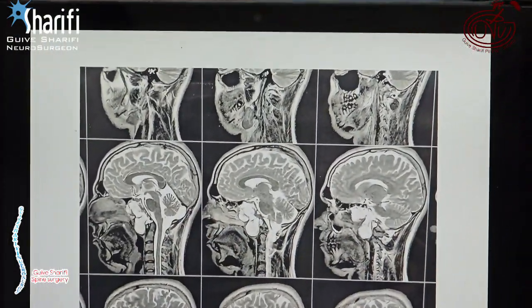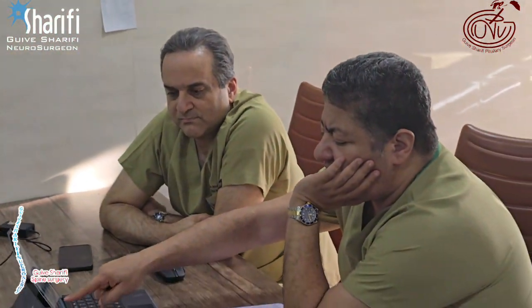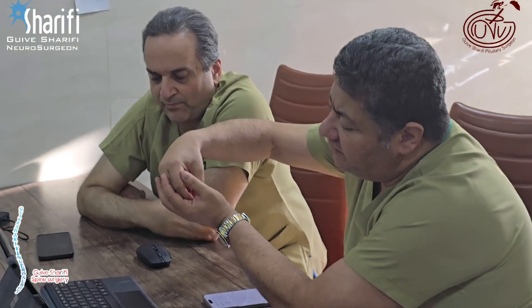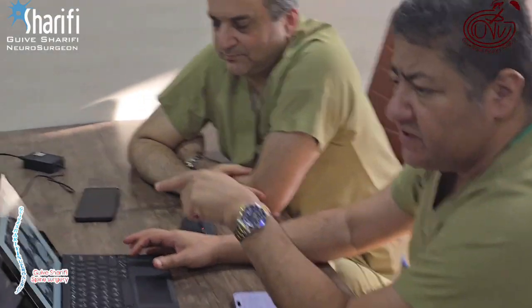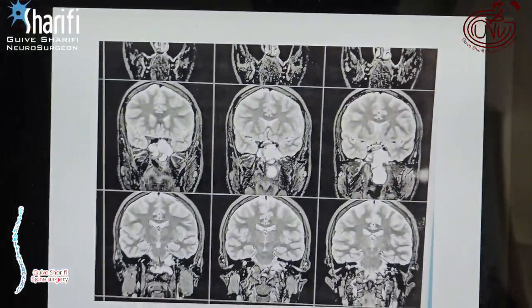Today we went and removed the whole prevertebral tissue. We go up to the disc of C2, C3. This tumor goes down inside the wall of the pharynx up to C2, C3. And yes, it is very important to remove this because this patient will come back with an airway problem.